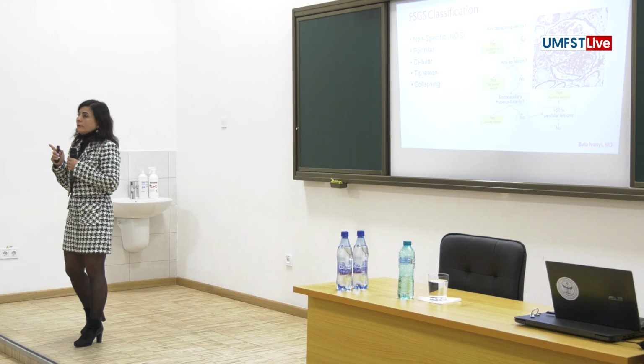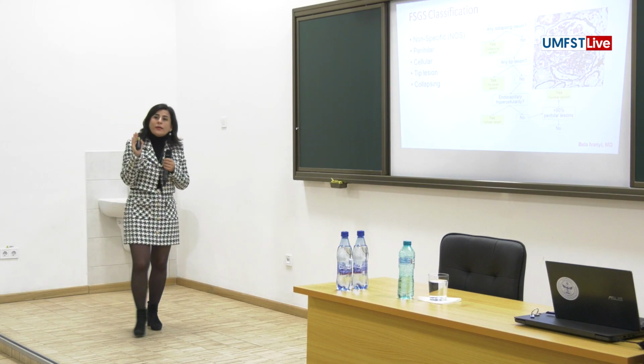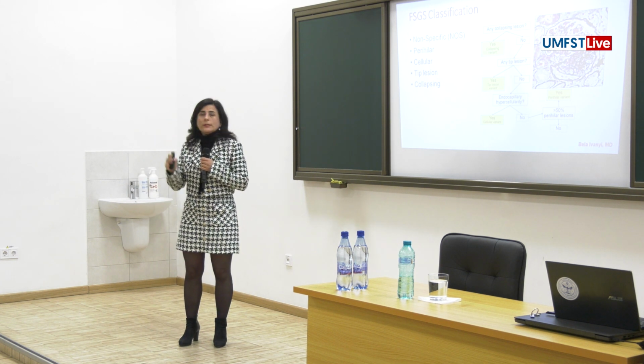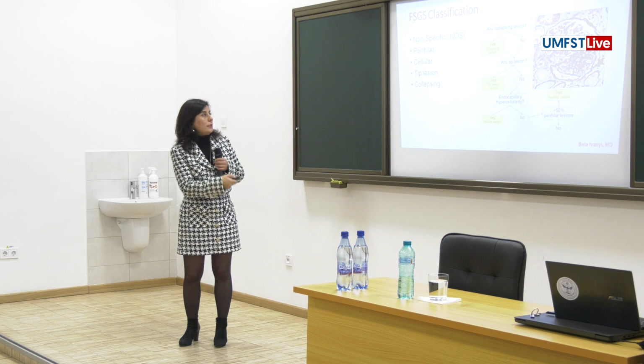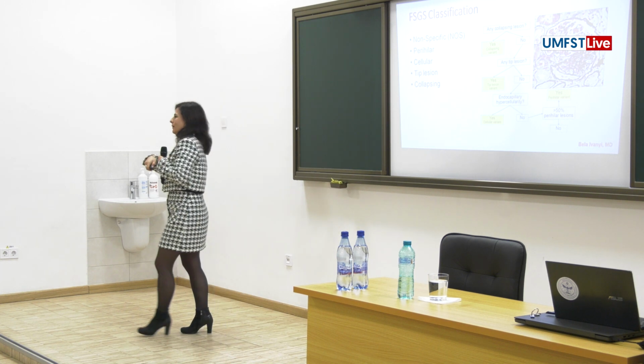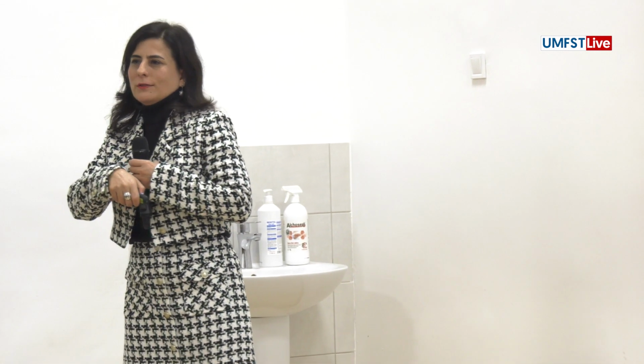If it's no, you have to search for any perihilar lesion. And if more than half of the lesions are perihilar, you have to call it a perihilar lesion variant. If you don't find anything, you cannot specify and you call it NOS.